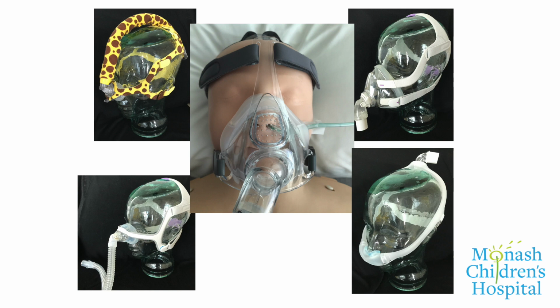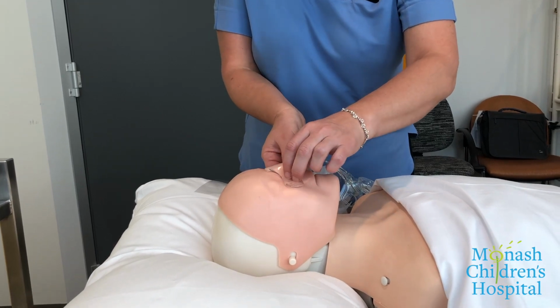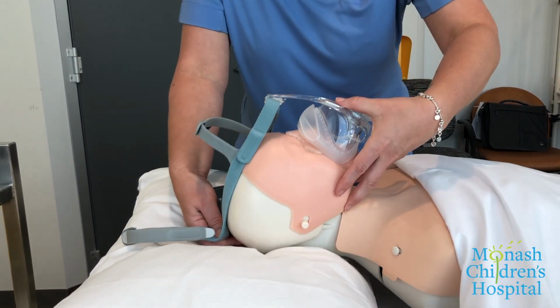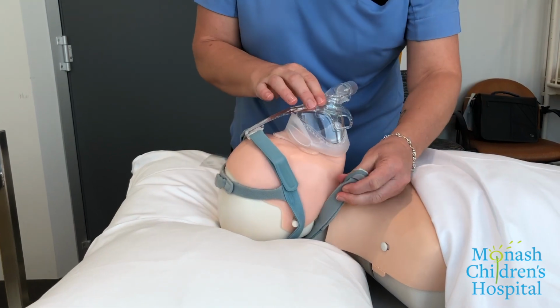Non-invasive ventilation can cause air to be swallowed, resulting in gastric distension, and so use of a nasogastric tube is ideal and should be regularly vented. A nasogastric tube sits under the edge of the mask without causing significant leak. Protect the skin from pressure sores with cushioned tapes or pads like Duoderm. This is best used before the skin breaks down, so assess regularly and use if skin is red, or use preemptively in children on more than just nighttime ventilation.